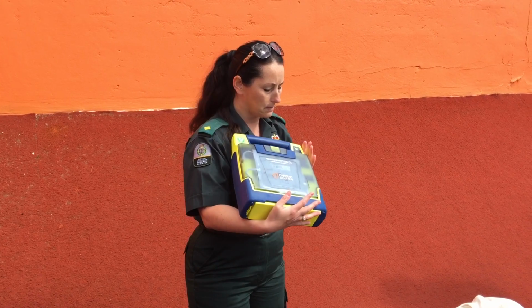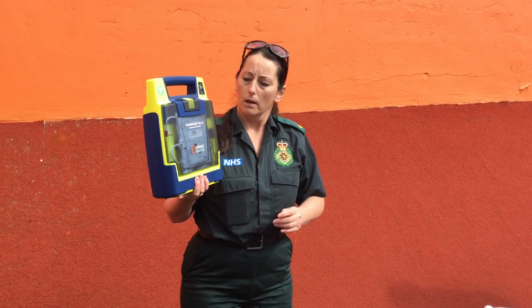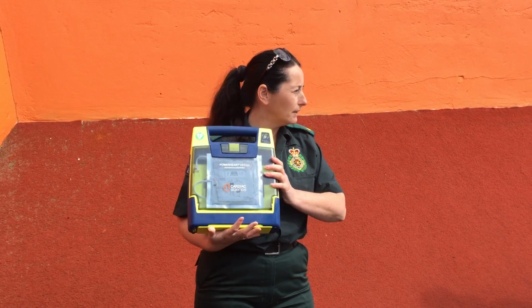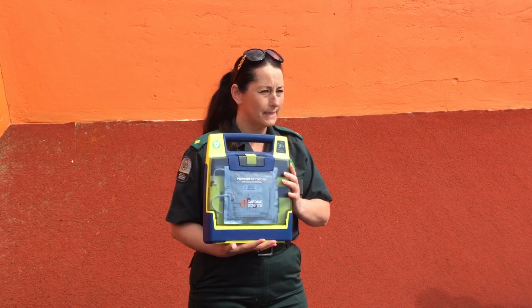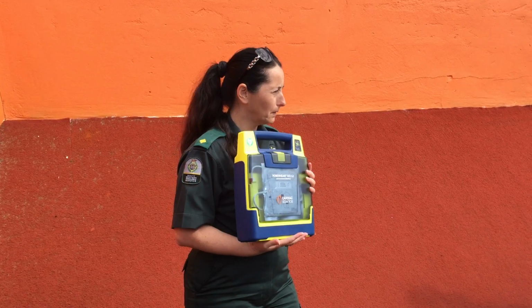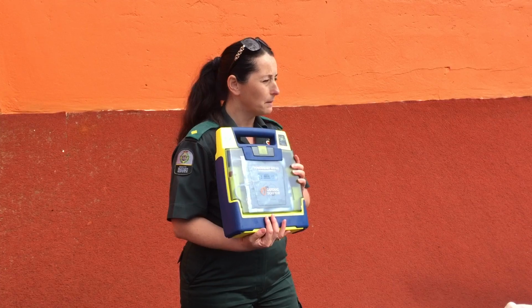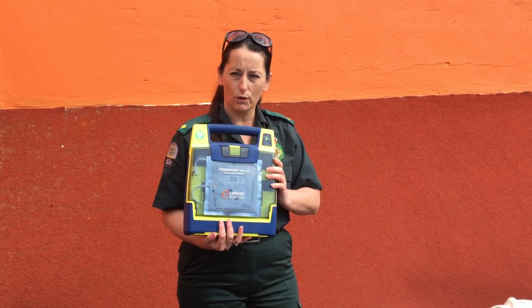Right, this will only shock the heart if the heart needs shocking. Not everybody is in a shockable rhythm. So you'll put the pads on and you will let it analyse, and then it will tell you whether that person needs a shock.